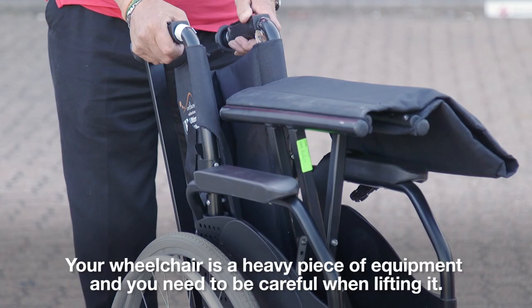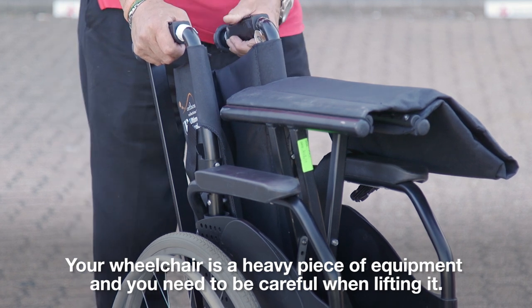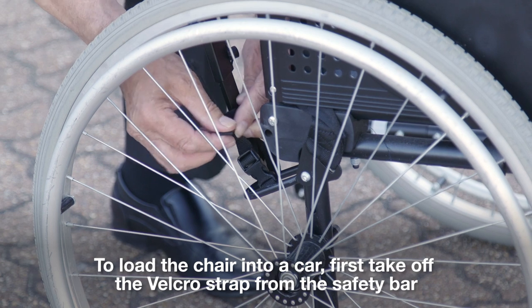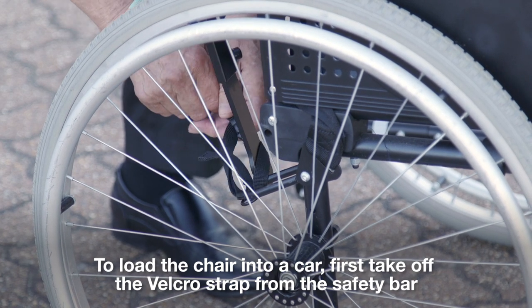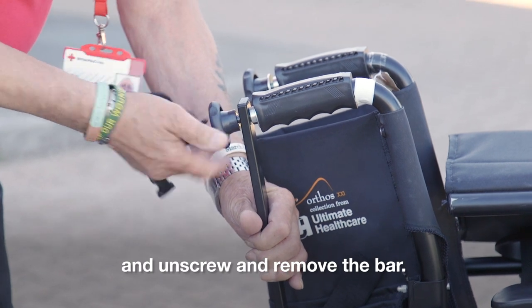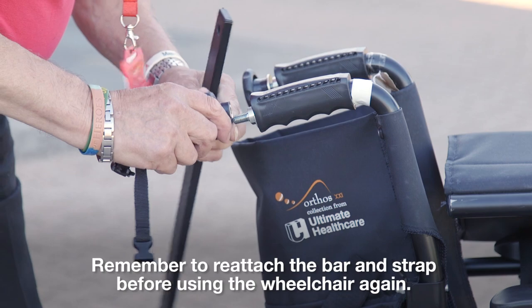Step 9 (Optional): Loading the wheelchair into a vehicle. Your wheelchair is a heavy piece of equipment and you need to be careful when lifting it. To load the chair into a car, first take off the velcro strap from the safety bar and unscrew and remove the bar. Remember to reattach the bar and strap before using the wheelchair again.